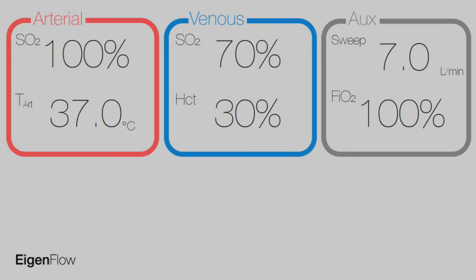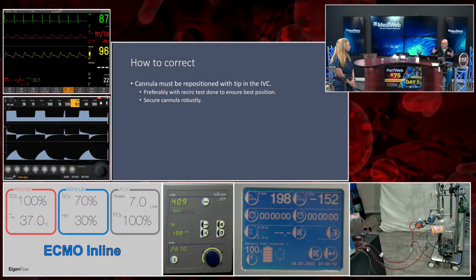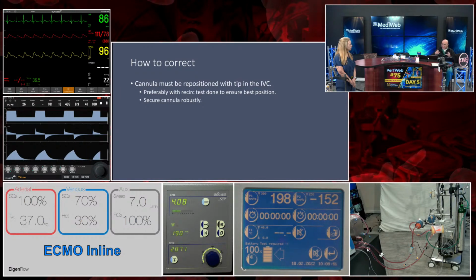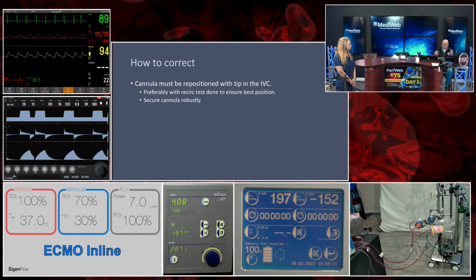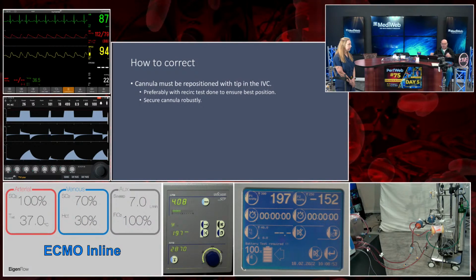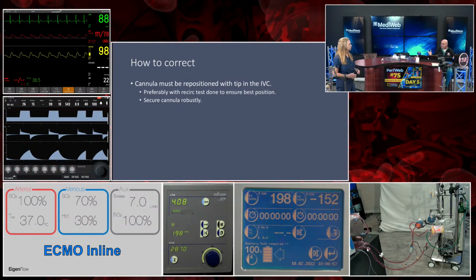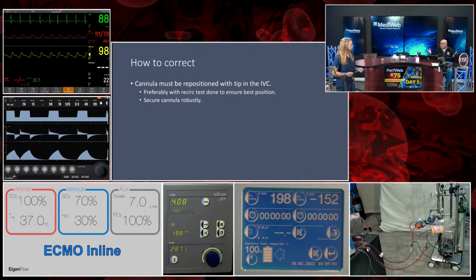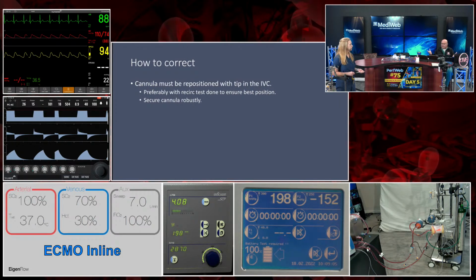Right. And so there's different ways of doing it. You can infer recirculation by trending your SVO2, but that can be other things. Temperature, extraction, right? A lot of different things can affect that flow. There's cardiac output. There's a lot of things that can affect that.